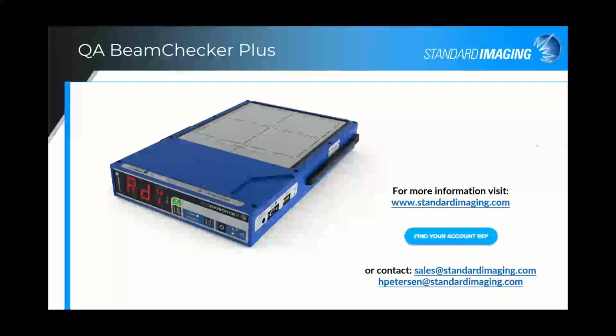Okay, one question: how does it know the beam energy? Basically, when you're baselining the unit, you tell it that you're going to deliver a 6 MV beam, and then you deliver that 6 MV beam. It saves the characteristics of that 6 MV beam, both on the software and on the unit itself. Then when you place the unit on the couch for that 6 MV beam in a specific room, it will recognize that characteristic, whether it's a 6 MV beam or a 10 MV beam. The unit essentially goes, okay, that was a 6 MV beam, I recognize it, here are your results.